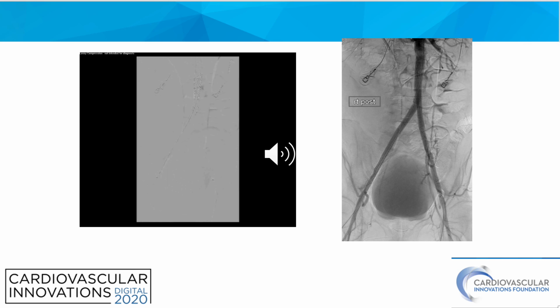This is not the time to really get away from your typical routine of making sure that you have an excellent final result. So a pigtail catheter was placed in the abdominal aorta, and a full angiogram was done at the end of the procedure to look and make sure we didn't have any extra perforations, no delayed filling of an internal iliac artery, potentially filling the rupture. And as you can see from the movie and the heightened still frame, you can see all the vessels being present with good collateral flow, no evidence of any extravasation.